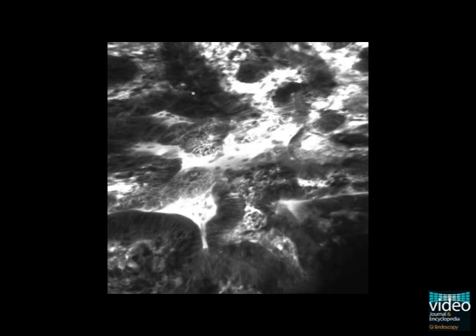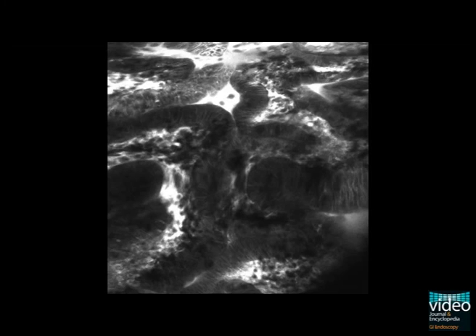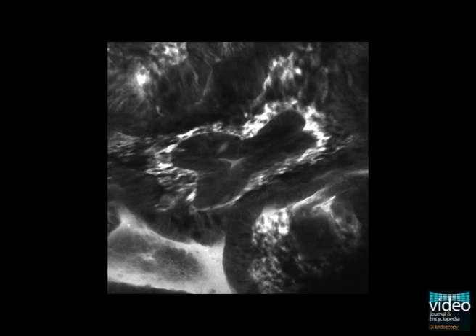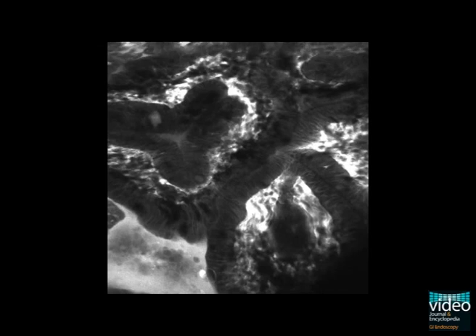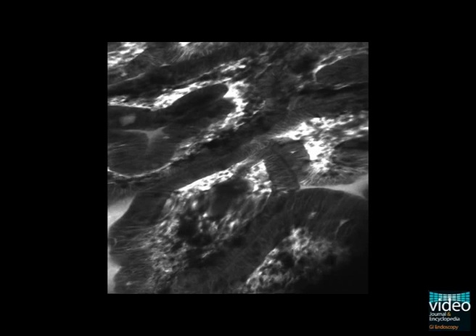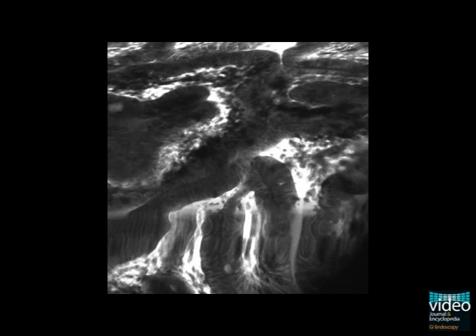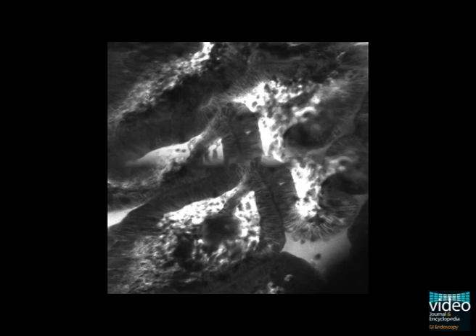Crowded glands with intraluminal folding, glandular budding and branching, pits of variable size, and massive leakage of fluorescein are observed. In some parts of the lesion, the epithelial height is still regular, and the basal membrane is intact, even in deeper optical sections.